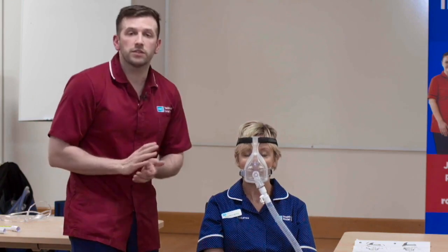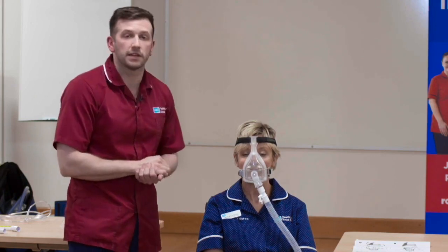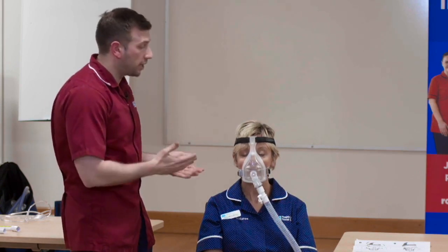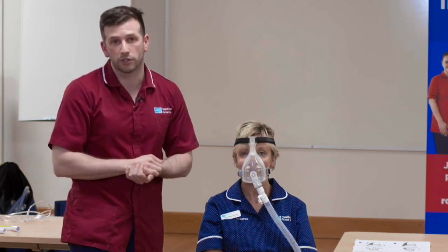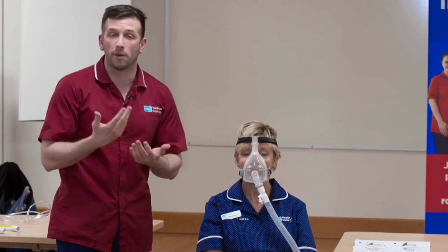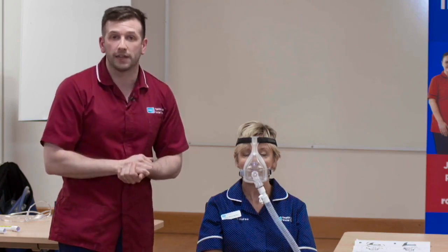It's important to educate your patient and staff looking after patients in non-invasive ventilation about the safe removal of the mask. Where possible, you want to educate the patient themselves to self-remove the mask in the case of an emergency. And the most common emergency that we consider is if the patient was going to vomit, because it will increase their risk of aspiration wearing a tight-fitting mask.